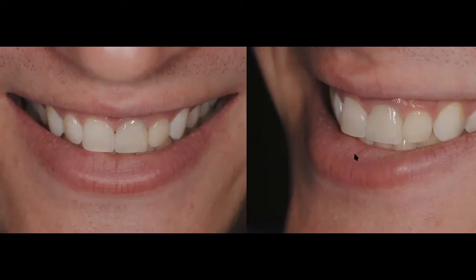So just little things that you say, well, how could he not have caught that? If he's looking at a cast and he's looking at a natural tooth, number 8, how can he not replicate that? Why is he not looking at that? And I'll show you a different photo just to share my critique on his work. Again, you can see a lot of gray on that mesial aspect, less on the natural tooth. But most importantly, look at the value.